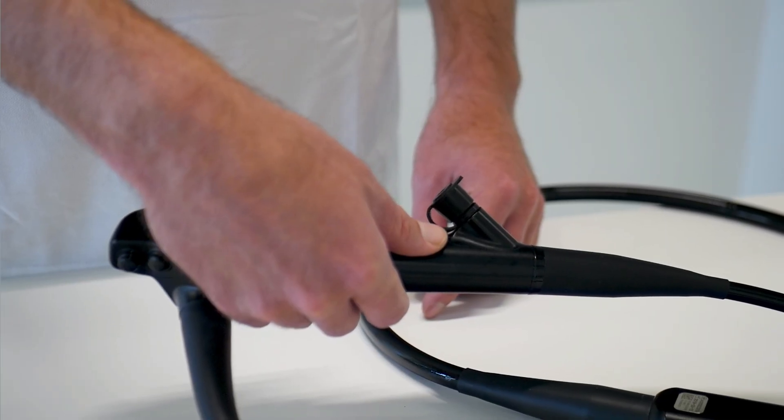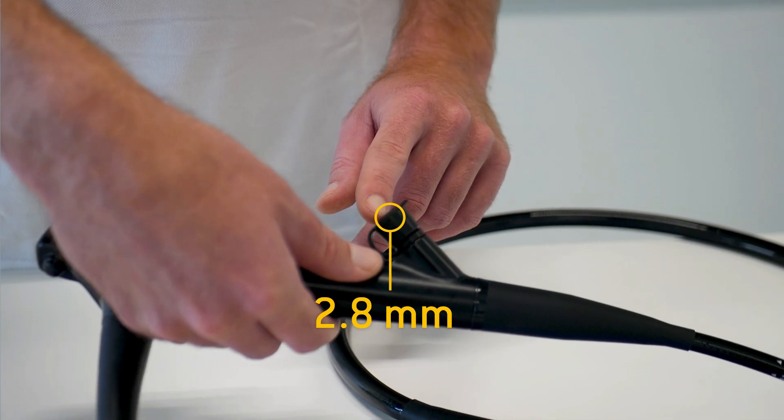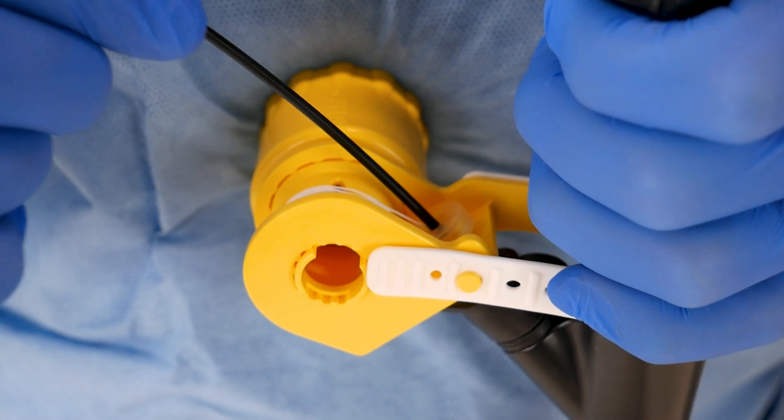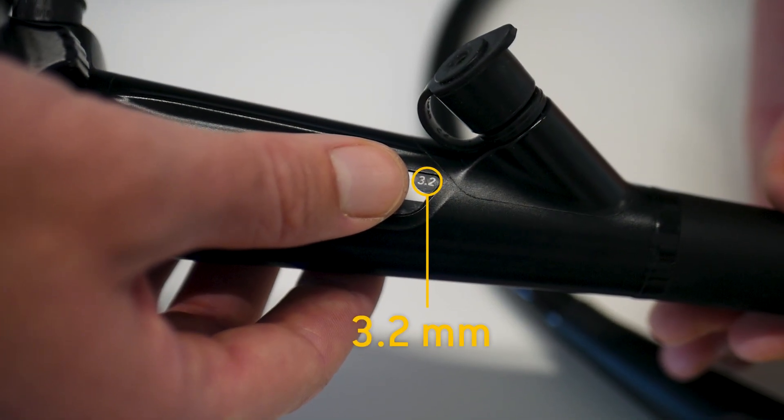The OTSC NEO system is designed for use with standard flexible endoscopes with a working channel diameter of at least 2.8 mm. If the system is used in combination with an accessory device, the working channel diameter must be at least 3.2 mm.